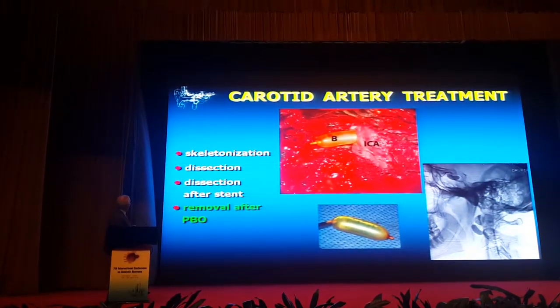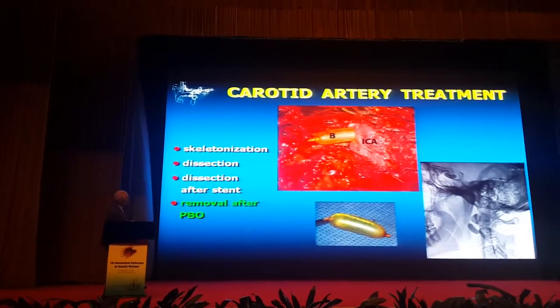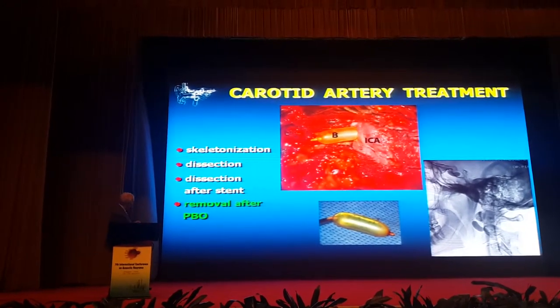For the carotid treatment, we use a balloon — removal after balloon. One, two, three balloons. This is the carotid with the balloon inside.